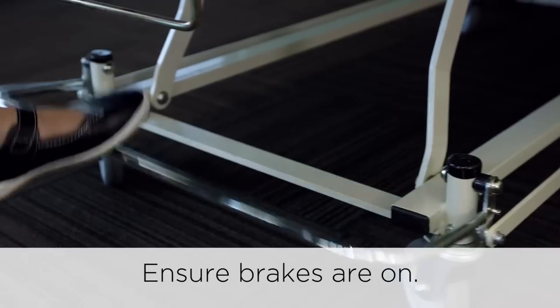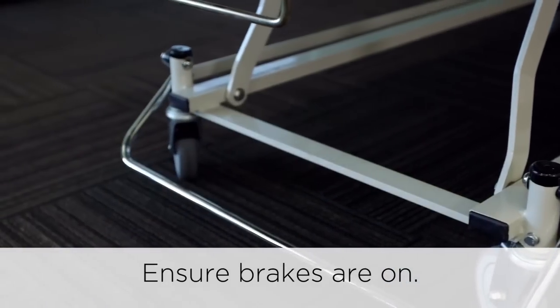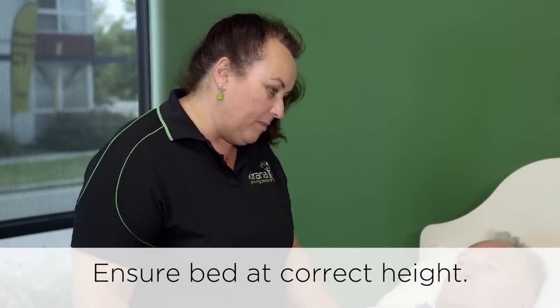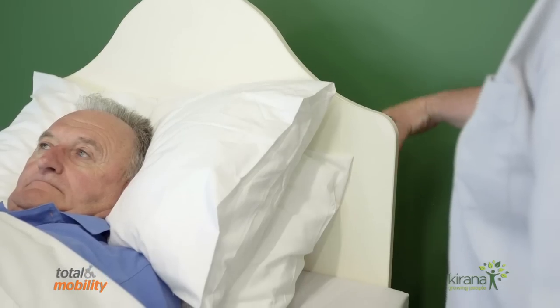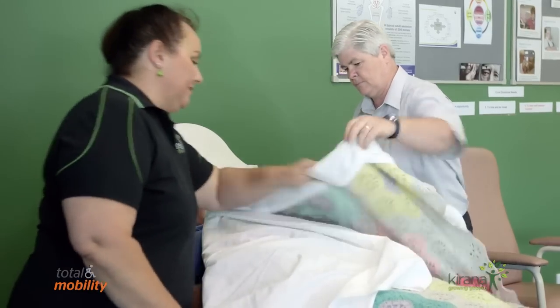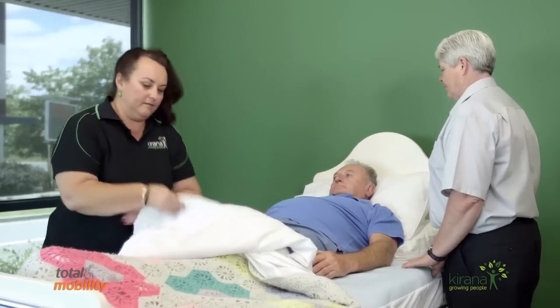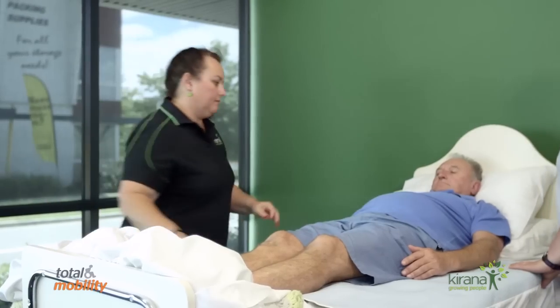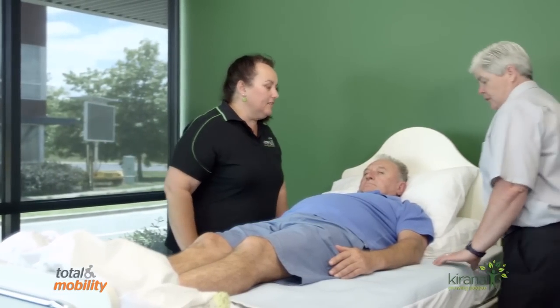First we're going to make sure that the brakes are on the bed, which I've just checked, and we're also going to make sure that the bed is raised to a safe working height, which Angela is going to do with the remote. While she's doing that Mr. Williams, I'm going to remove the blankets for you. Is that good for you Angela? Good for me, lovely.